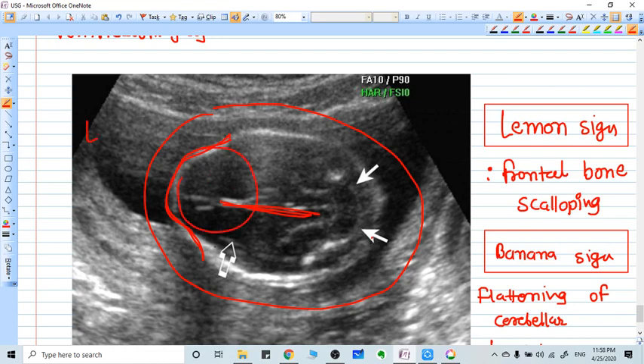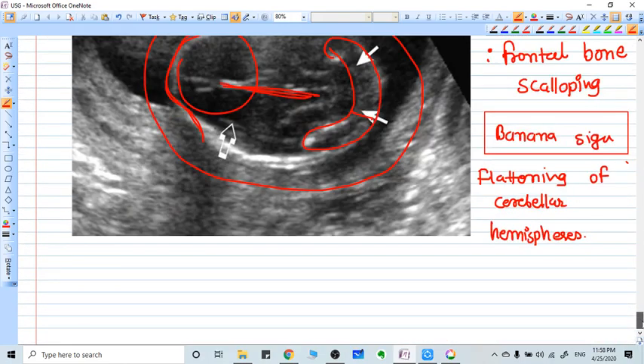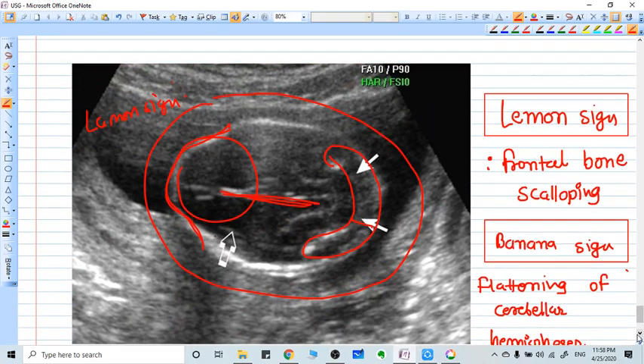That is why it is called the lemon sign. Now if we go to the posterior of the head, the cerebellar hemispheres are flattened, which is why it looks like a banana — that is the banana sign. So in spina bifida, there is the lemon sign and the banana sign.